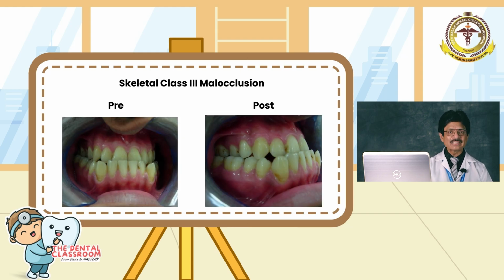So now this is a small example where a patient has a skeletal class 3 malocclusion. He has a little bit of a retrognathic maxilla and prognathic mandible. The patient does not prefer orthognathic surgery. He's a skeletal class 3. So what I thought I would do would be, why not place a microimplant between the mandibular first molar and the mandibular second premolar, and after having extracted the mandibular first premolars, I would attempt to retract the whole mandibular arch into the extraction space.